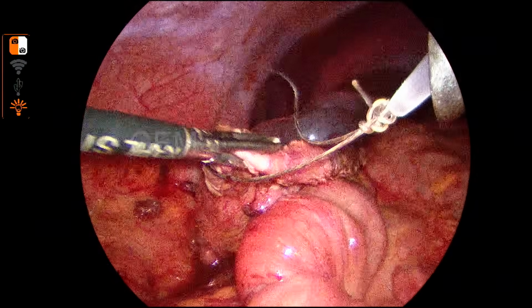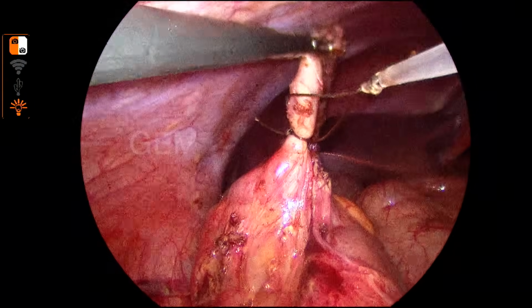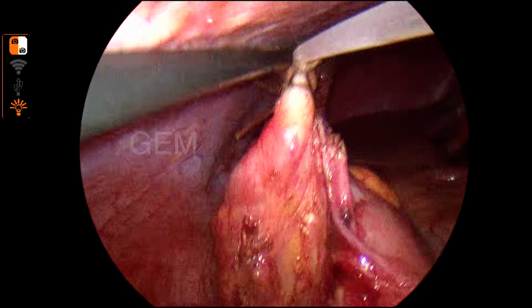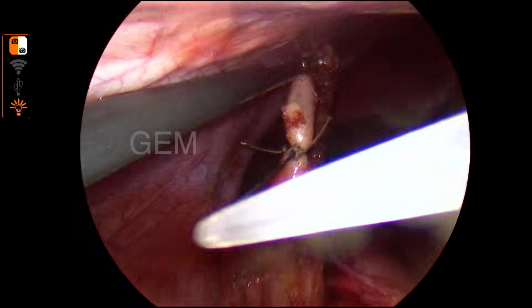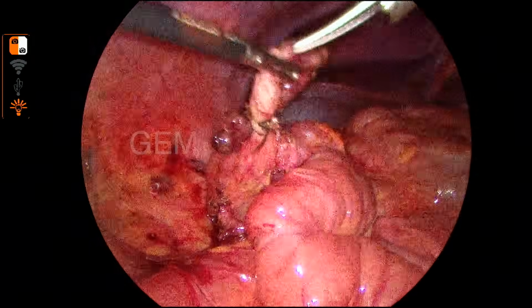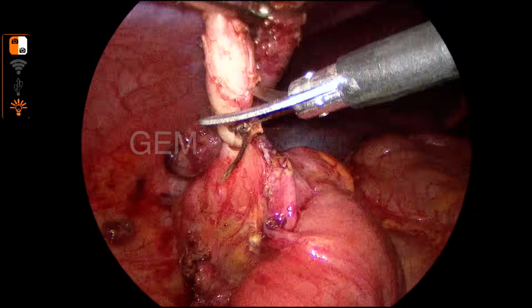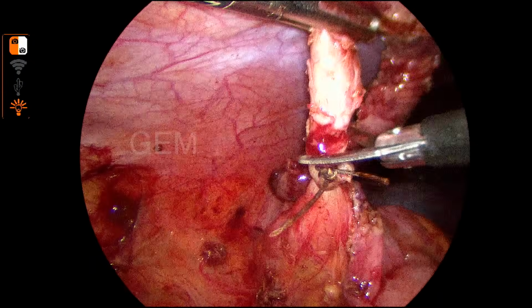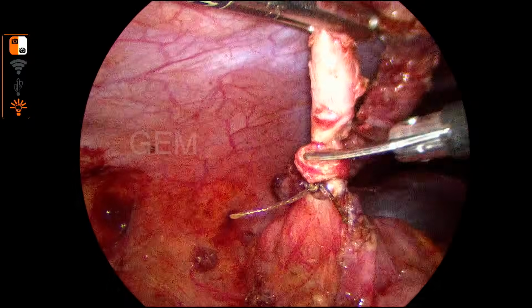We divide the mesoappendix, and then now we are ligating the appendix with the catgut endoloop. Already one at the base is applied, and this is the other one, around 2-3 mm distance, and now I am dividing the appendix. So this is all the regular standard procedure you can see in a regular way.